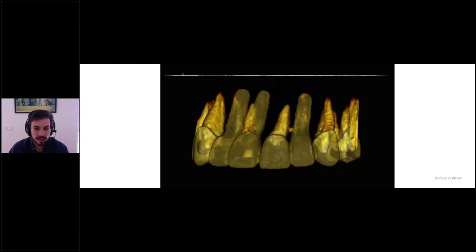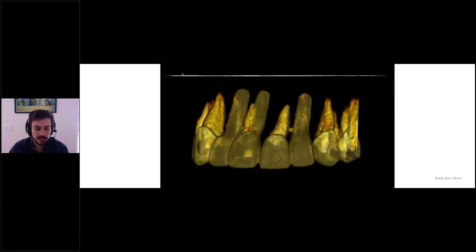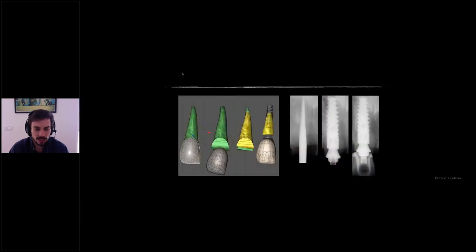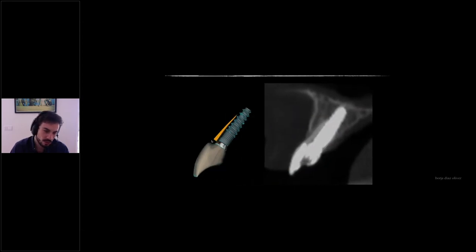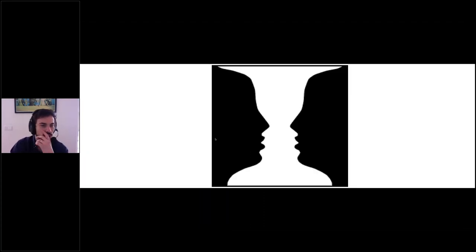The implant goes behind the root, then you put your crown, and in the next minutes we'll talk about the crown designs and provisional designs, which have to be different in some aspects to allow the soft tissue to grow inside here and not have external or internal shield exposures. So we have to look at things in a different way, and change the way we think about implantology once we start performing partial extraction therapy techniques.